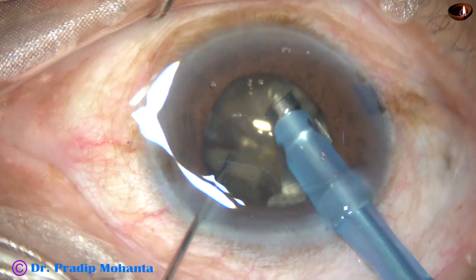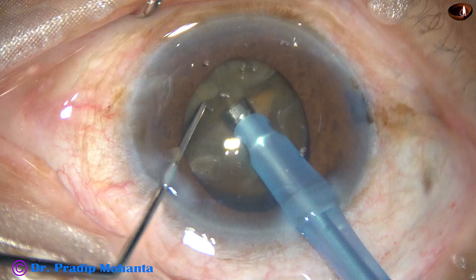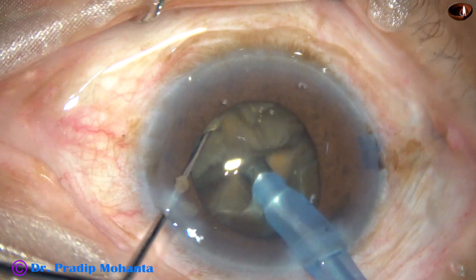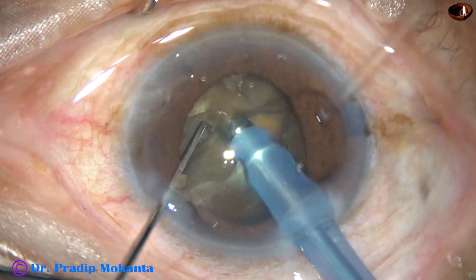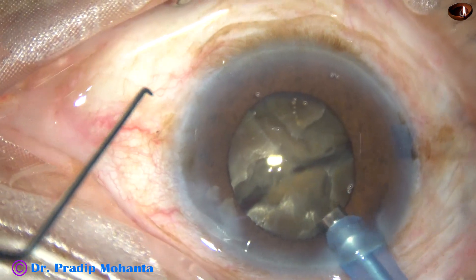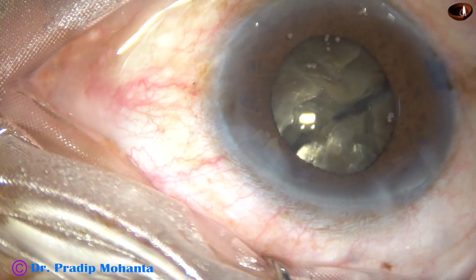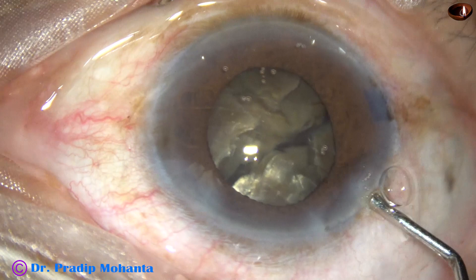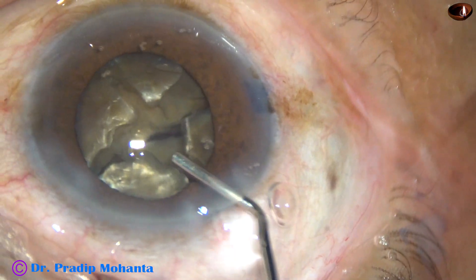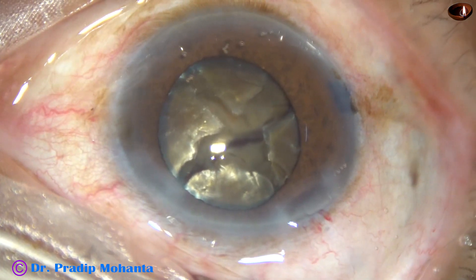I go through a deeper plane and try to get the edge. The pupil is coming down — the size of the pupil is becoming less, about 5 mm or 4.5 mm now. The two fragments are joined to each other by leathery fibres.